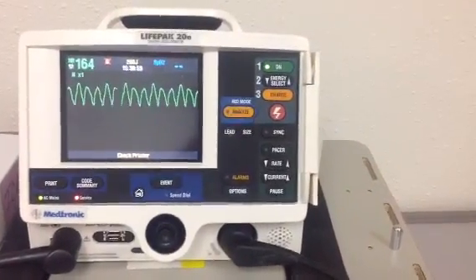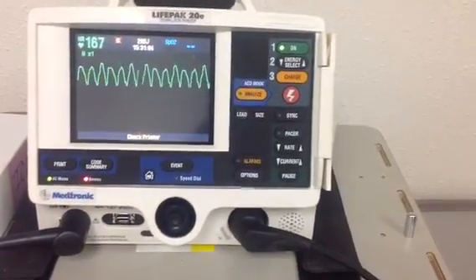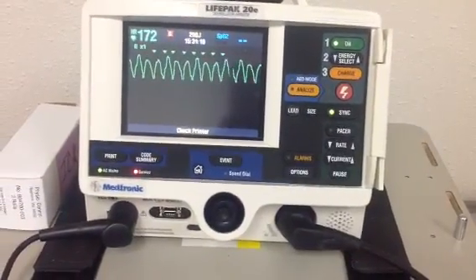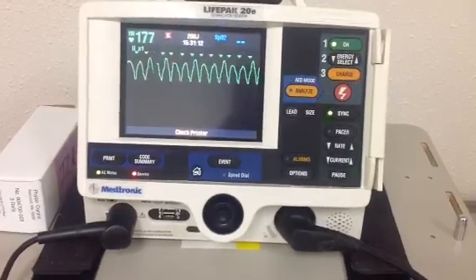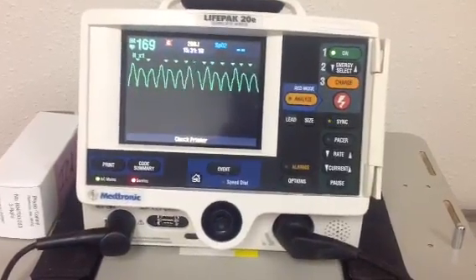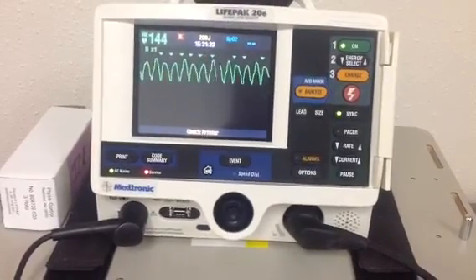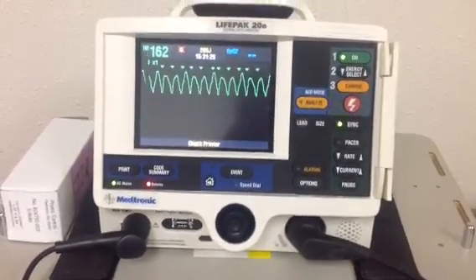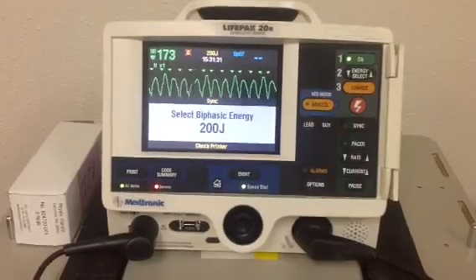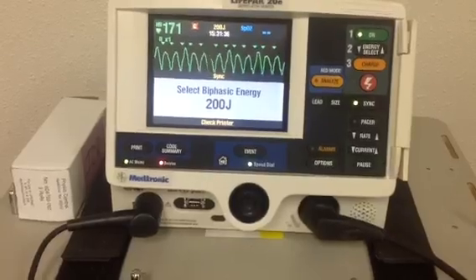To cardiovert, what we are going to do is we're going to hit the energy selection button and we're also going to hit the sync button. When you hit the sync button, you get a little triangle-like marker that's going to appear on the monitor — it should be on your R-wave. And then we're going to select the energy joules and depending on the ECG pattern, you will select whatever energy is appropriate for that particular rhythm.